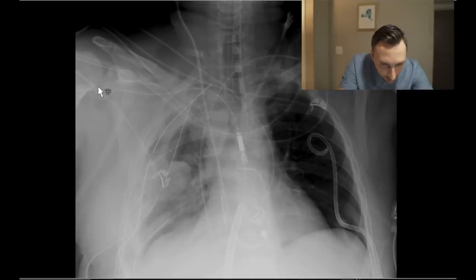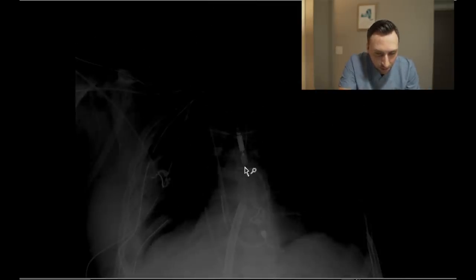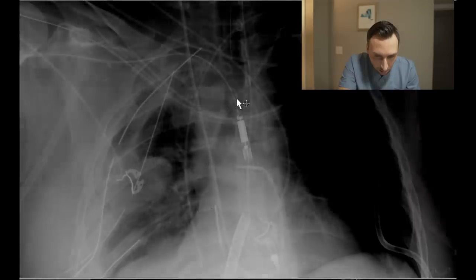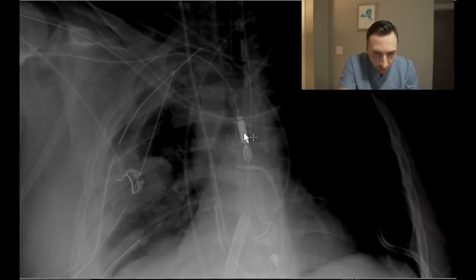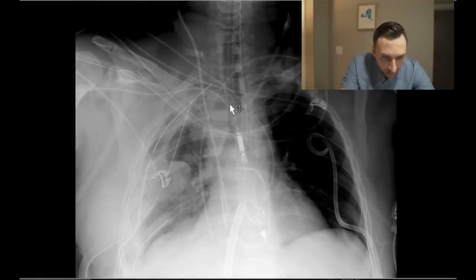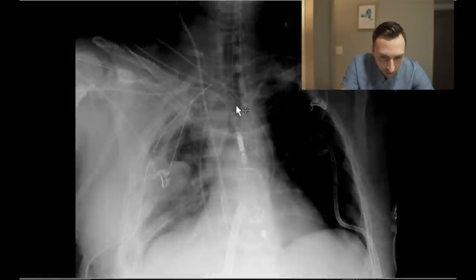The first thing I notice here is a right subclavian approach Impella device. Let me see if I can window in right there. As you can see, this is the Impella device coming from the right subclavian artery. Since I'm on the right already, I'll keep working my way from the right.